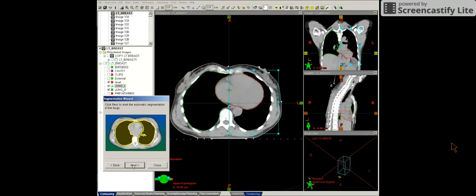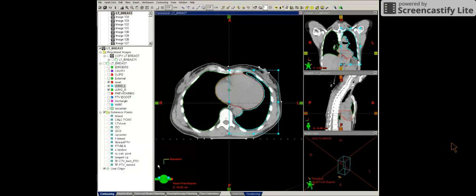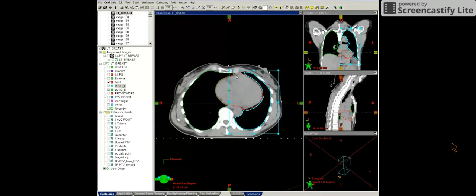Select lungs. Select next. This helps autofill in the lungs. It's not perfect, so I will have to do some hand editing.